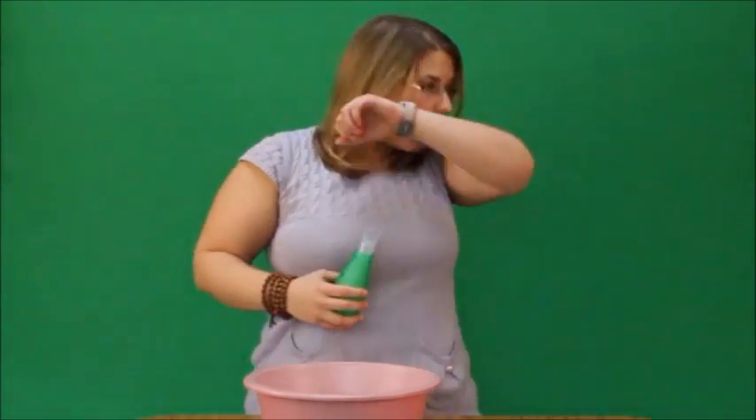To cough, you want to make sure that you have a deep breath in, hold it for a couple moments, and then have two to three coughs. Deep breath in, hold — one to loosen the secretions and then one to clear the secretions.